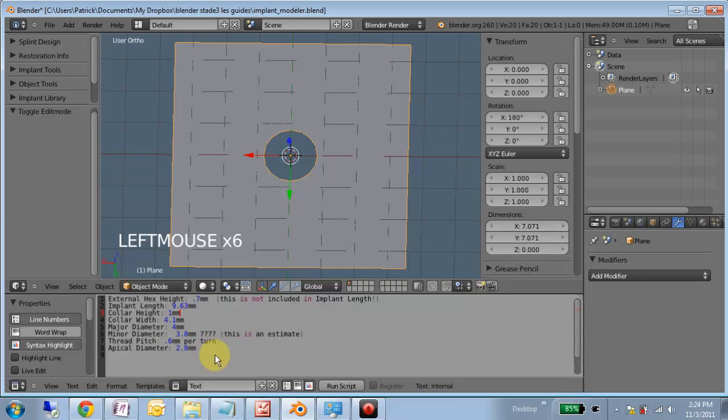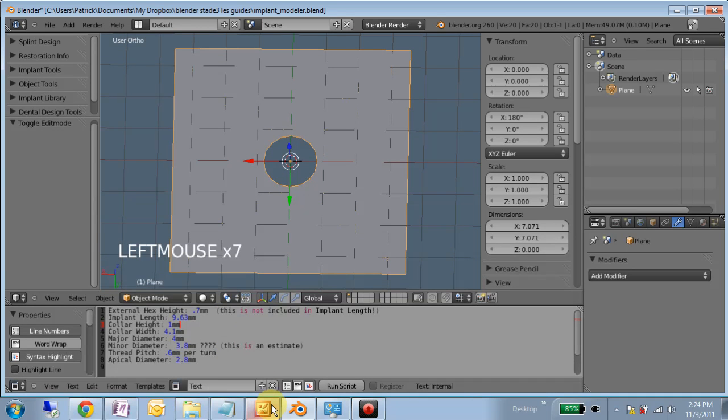For this particular tutorial, I've just made up some numbers here, and we'll have an external hex, non-tapered or parallel-sided implant that's approximately 10 millimeters. Notice it's actually 9.63.